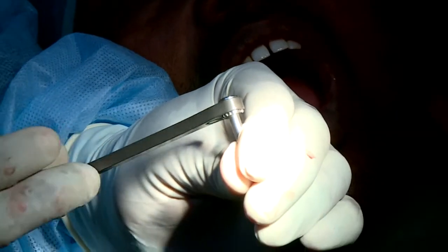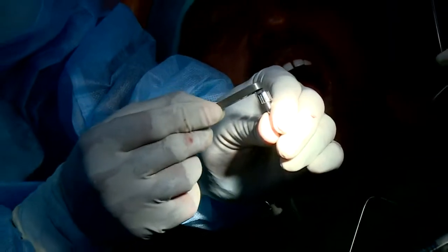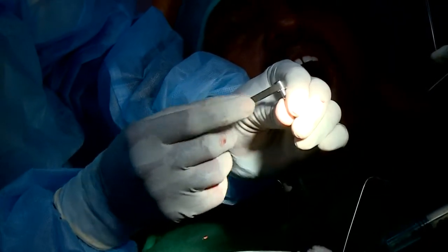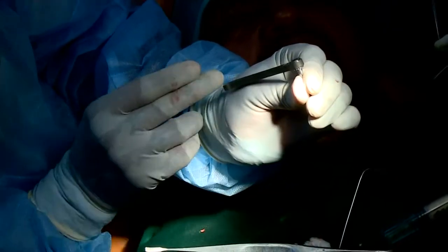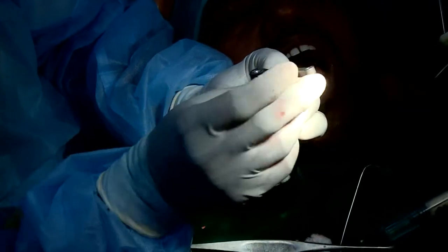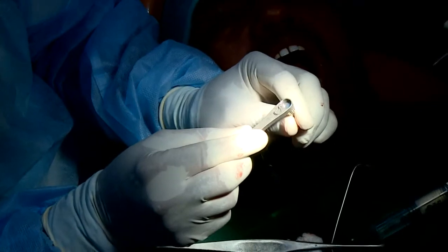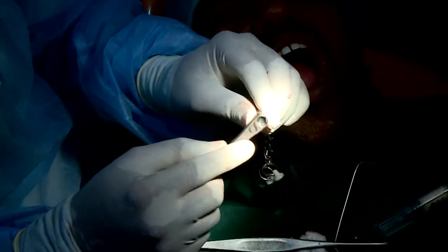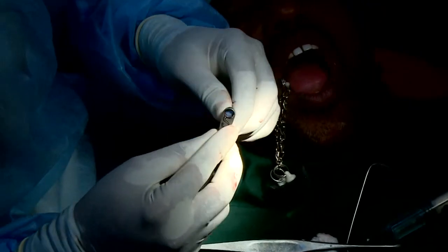Now, when I want to loosen it up, I have to take the same thing out and put this upside down. Now, when I am loosening it up, it will turn. But when I do tightening, it doesn't turn. Are you able to see it through the video? Yes, sir. Excellent. So now we are going to use the inserting tool. Here we have both sizes depending upon which area we have to go.